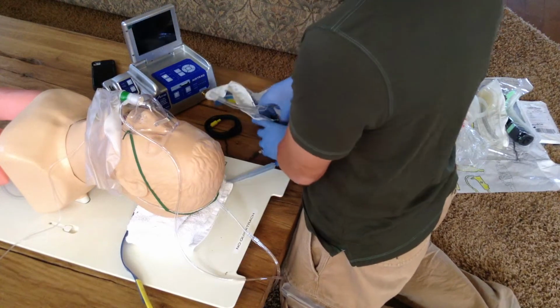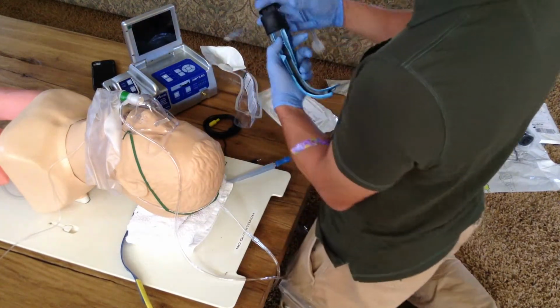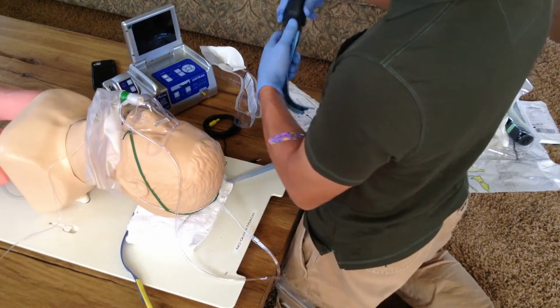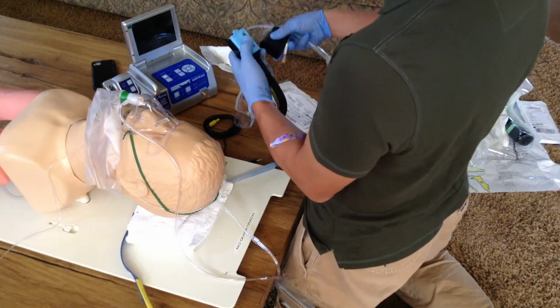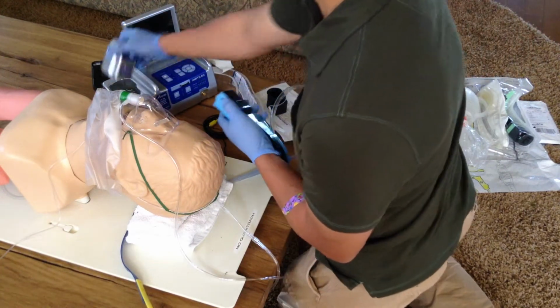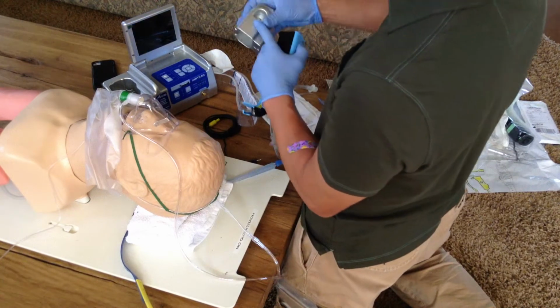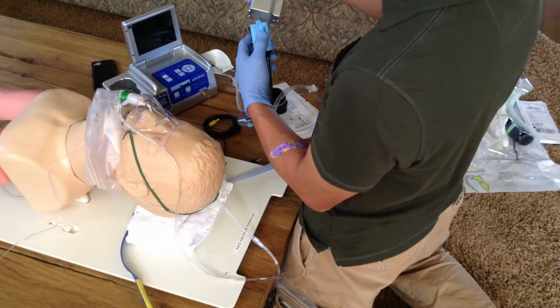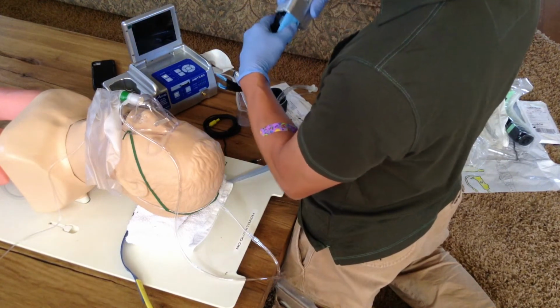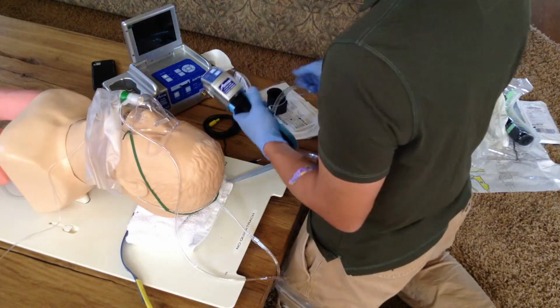So just over the setup, take your Airtraq out, take the plastic cap, rubber cap off the top, take the video Airtraq, insert this whole side with the switch. This plastic tab snaps into place.